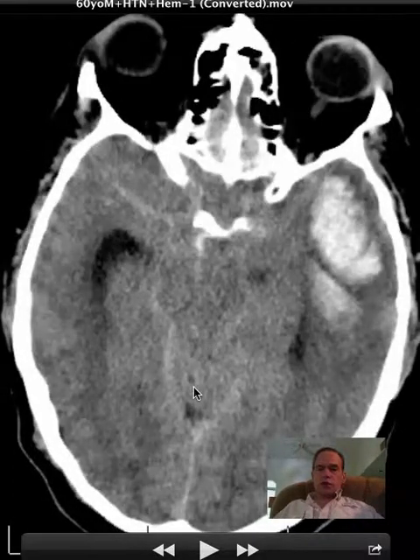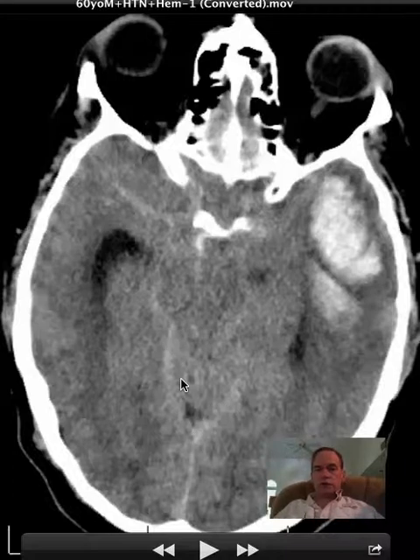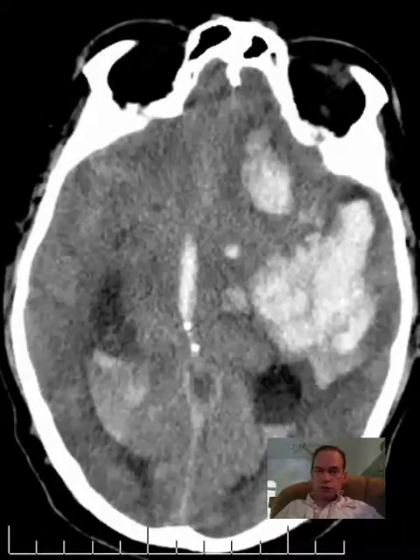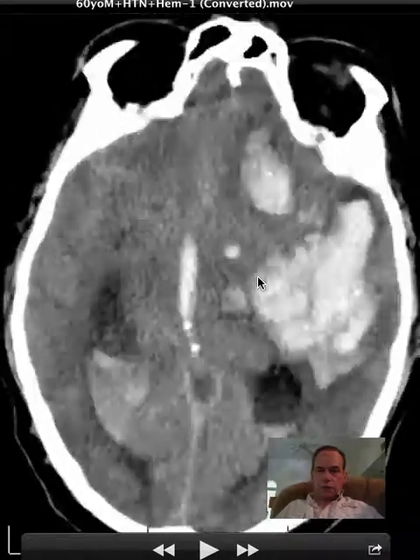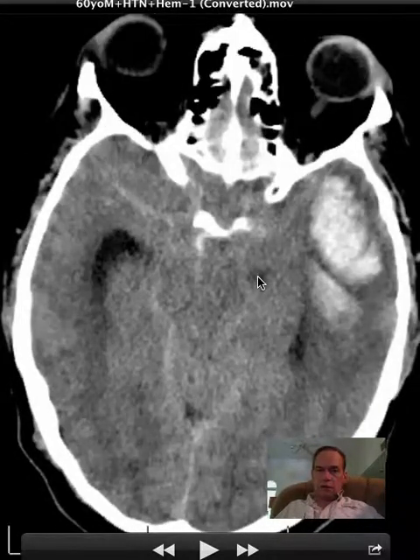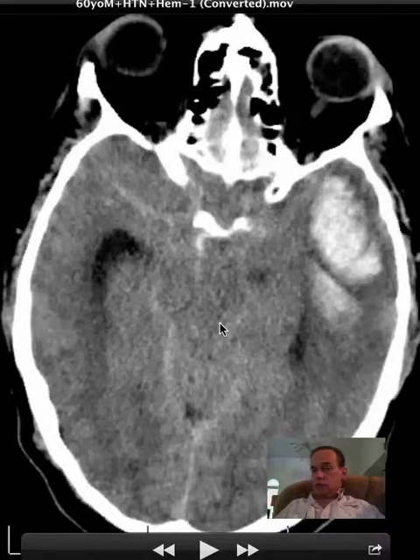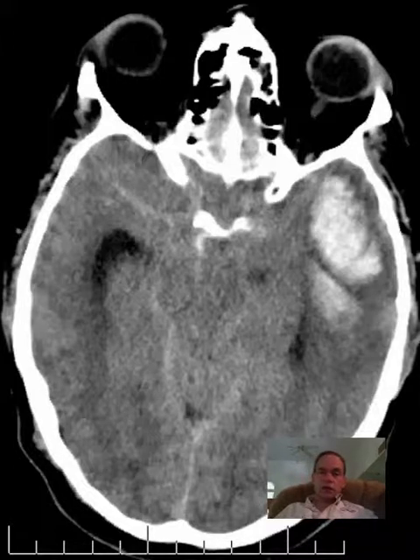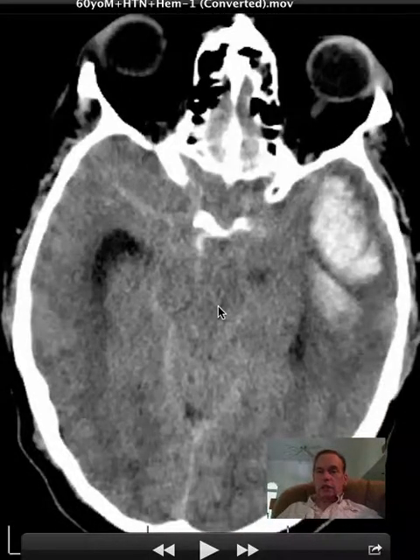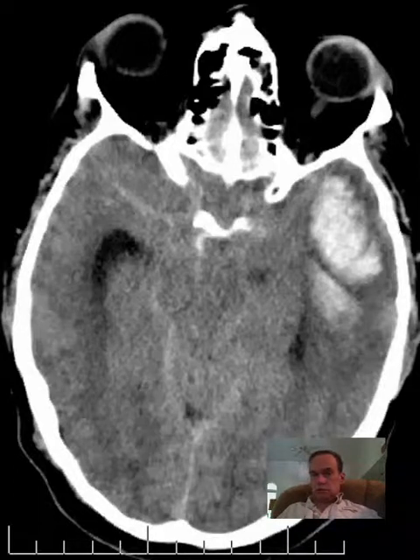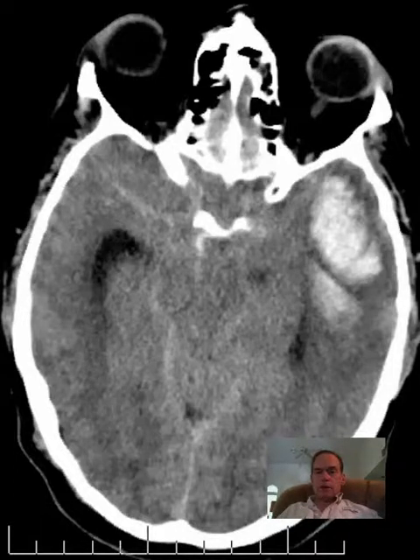Here you have a portion of the cerebellum peaking up superiorly through the tentorial incisura. The important point is to appreciate that a large hemispheric hemorrhage can produce intraventricular extension and mass effect, and that mass effect can produce significant compression of the brainstem — and that can cause death. Compression of the brainstem can also cause blockage of the cerebral aqueduct, and together with blood going into the ventricles, steps must be taken to decompress the lateral ventricles because this will otherwise certainly result in death.